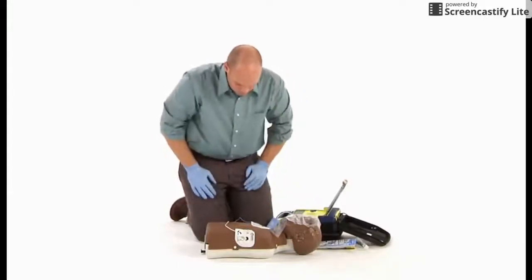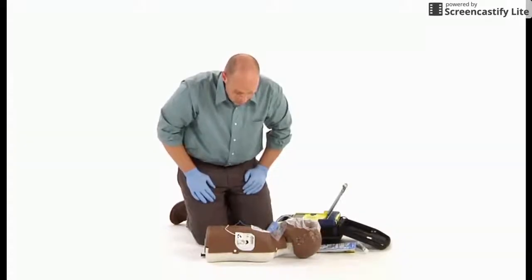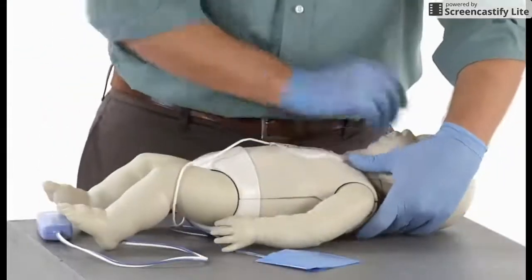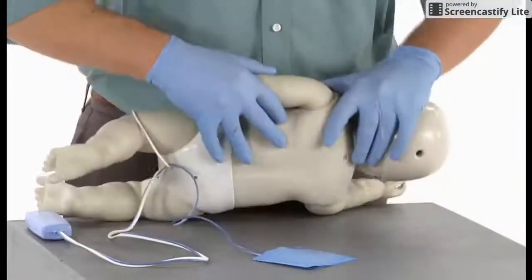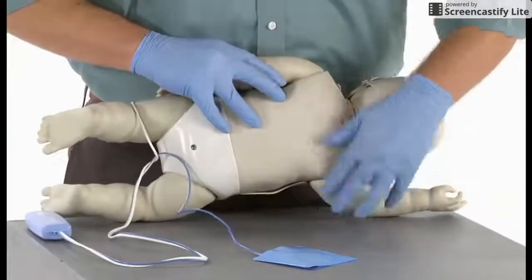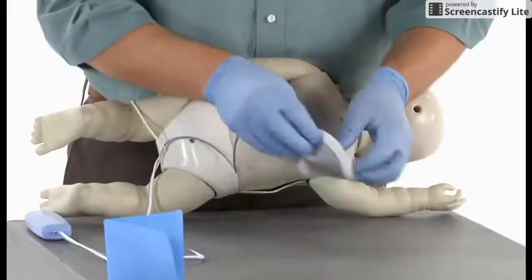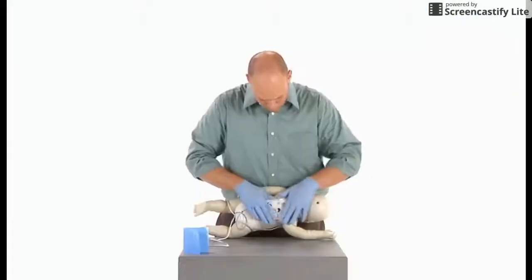Do not touch patient. Analyzing heart rhythm. Everyone stand clear. For a small child or infant, the pediatric pads may be too large to fit on the chest without touching each other. You may need to attach one pad on the center of the chest and the other on the back between the shoulder blades.